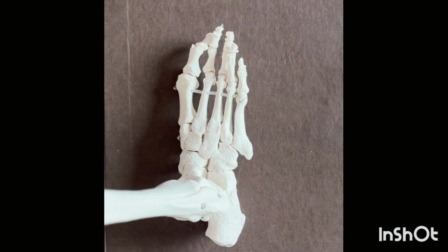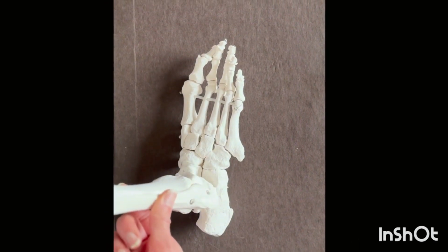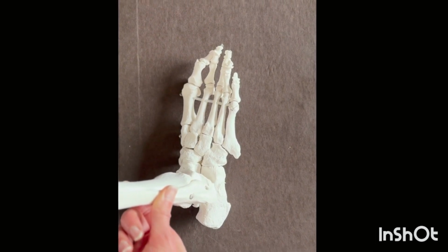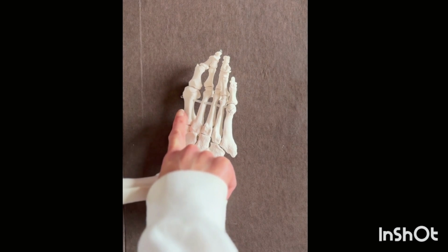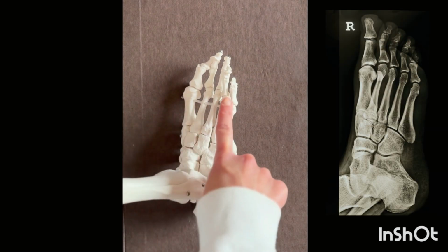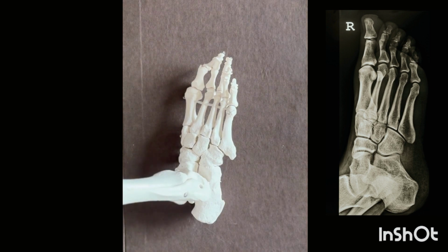In a medial oblique foot, the third through fifth metatarsals will be seen without superimposition, in addition to open joint spaces. The first metatarsal will be closer to the image receptor, and then the fifth metatarsal is brought further away from the image receptor. This allows us to see more of the lateral surface of the foot.